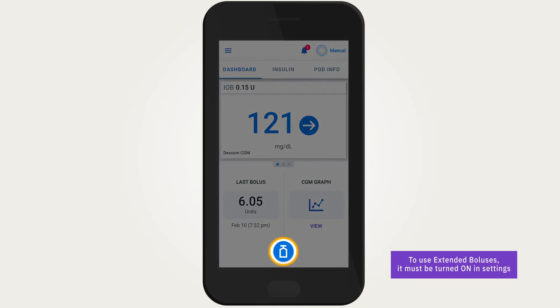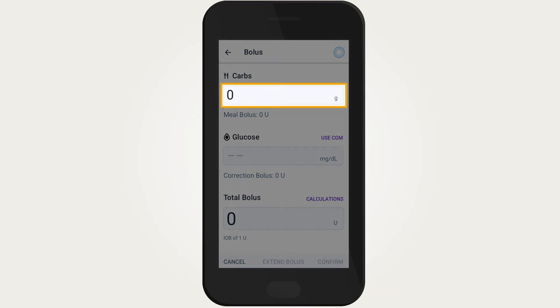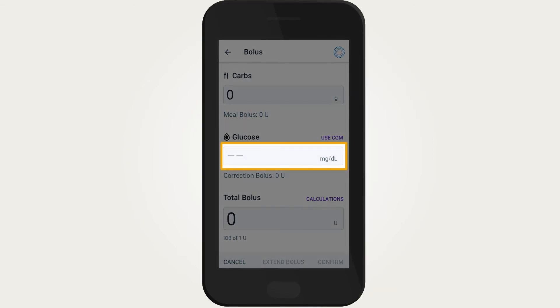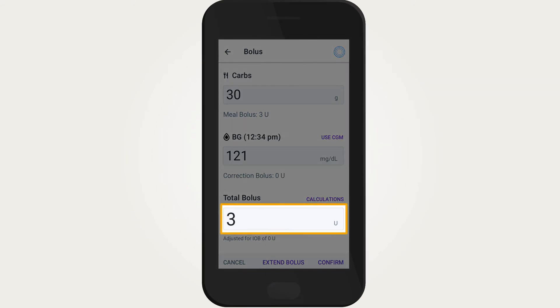To program an extended bolus, tap the Bolus button to use the Smart Bolus Calculator. Enter grams of carbs and glucose and/or CGM value. Confirm your entered values and suggested bolus amount.